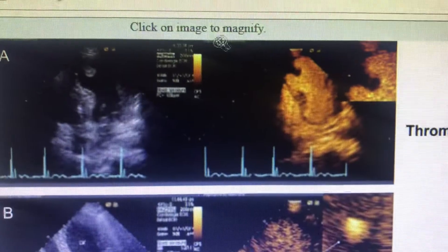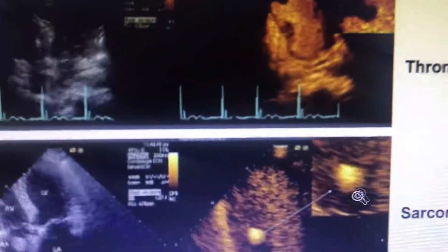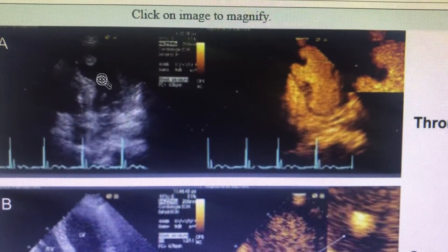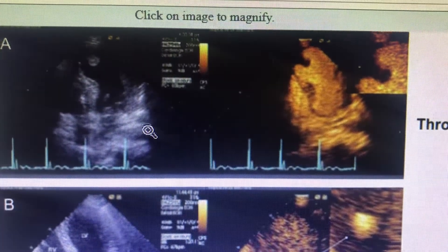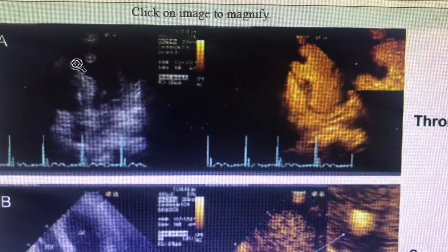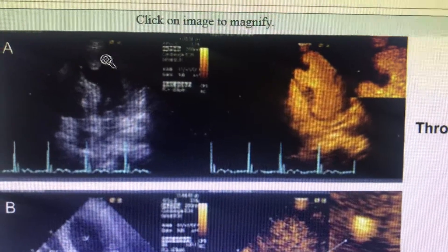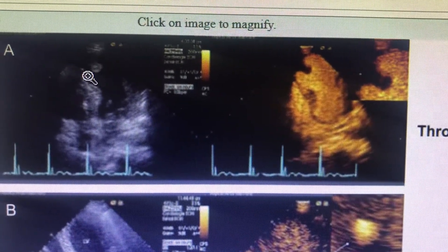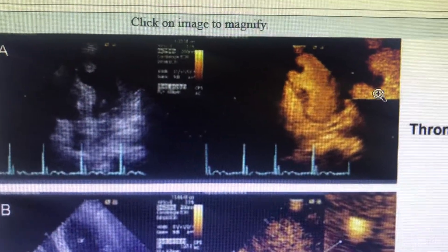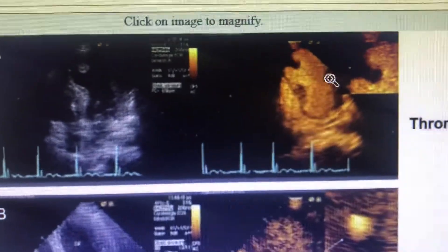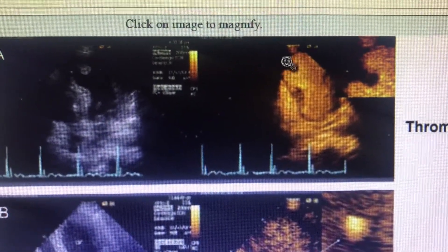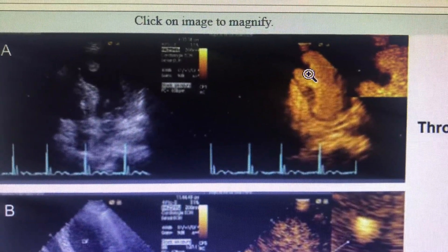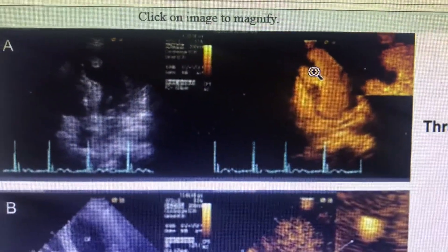A very important thing is how contrast echo helps. A thrombus attached to any chamber usually attaches at a site of regional wall motion abnormality — there is an RWMA and the thrombus is attached to it. When you do contrast echo, you can see that the structure is absolutely avascular. Most of the time, avascular structures on contrast echo are thrombus.